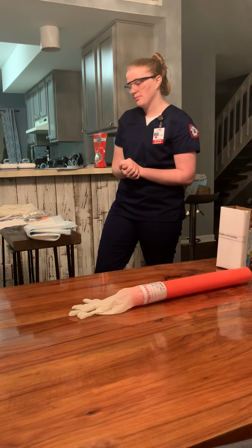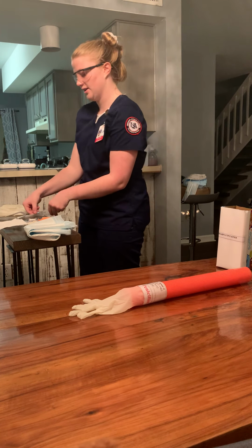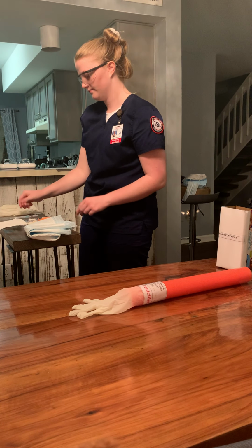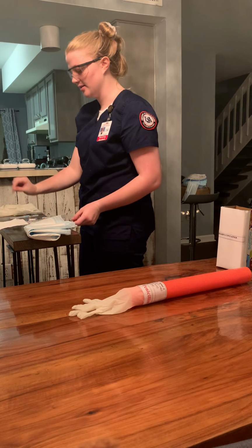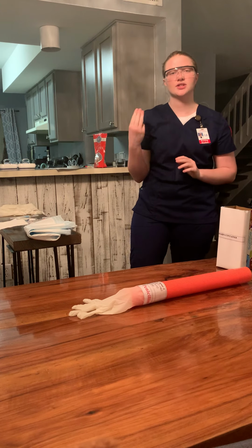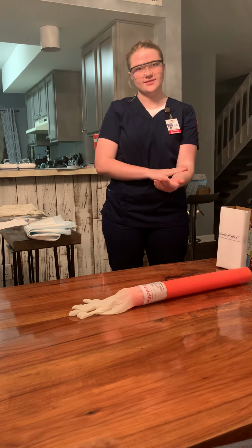And so now I'm going to go ahead and remove my over the needle catheter and set it aside, and then remove my Tegaderm and just set it aside. And so now I'm just going to verbalize 3 ways to choose or assess a vein site.